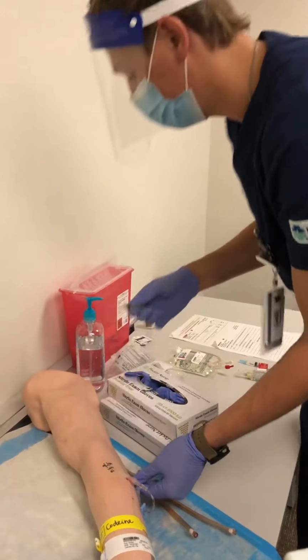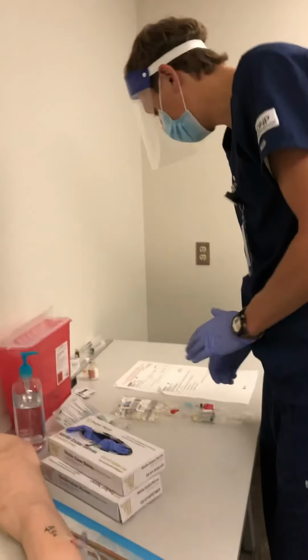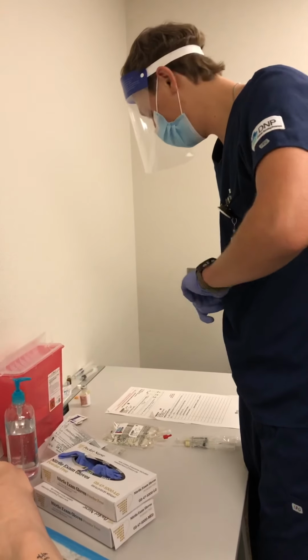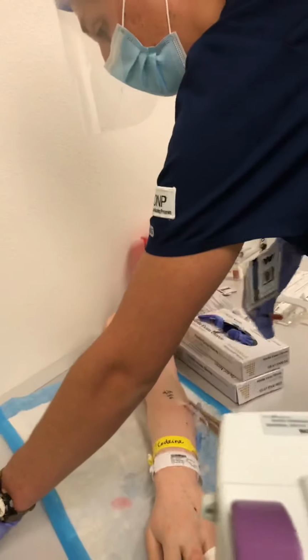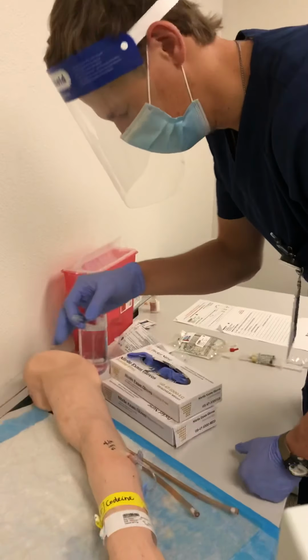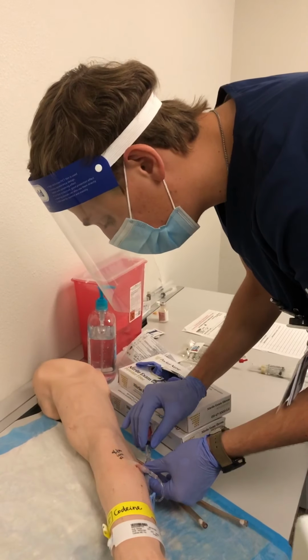Okay, so once I'm done with that, that can go into the garbage, and then I can get ready to instill my morphine here. Okay, and since this was sterile from the med room, and I cleaned that and that stayed sterile with the sterile saline flush, I don't need to clean the site again. So I can go ahead and connect this.